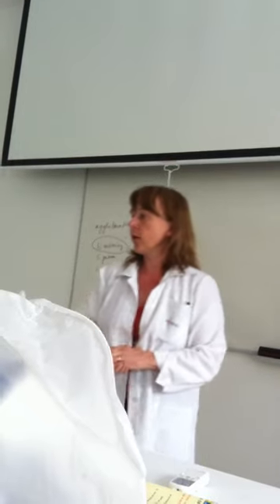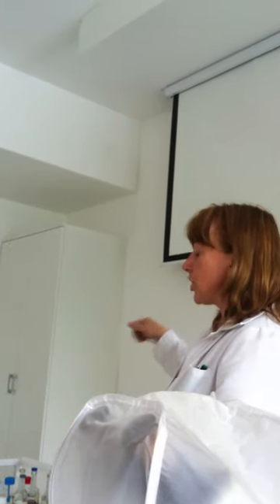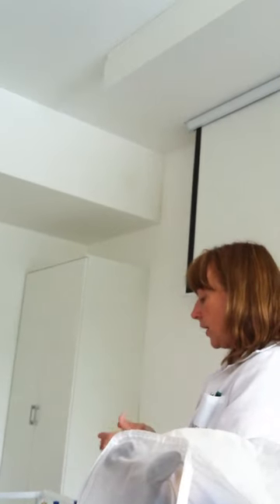Yeah. But with the sediment, again, what do you do? You just measure the white blood cells, and there is another part, because one part is coming to the micro, another to the clinical chemistry, and they will check the protein, the leukocyte number, because I just see in the stain preparation that there are leukocytes, but they are measuring, and they are checking the glucose and the others. So there are general data, and the specific is the culture.